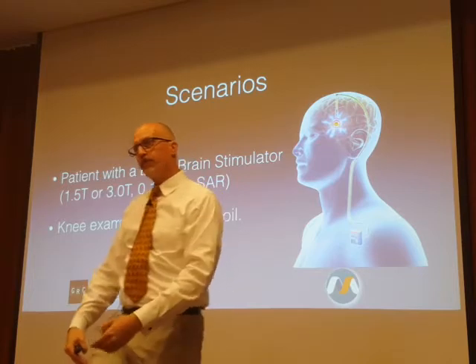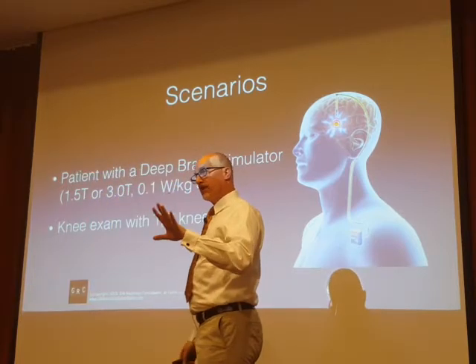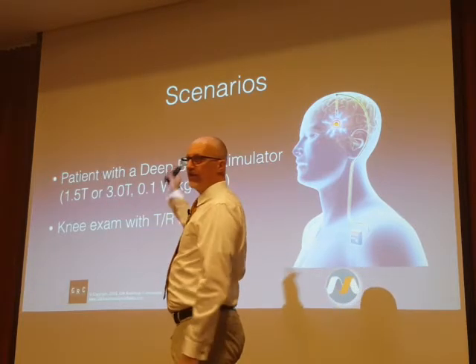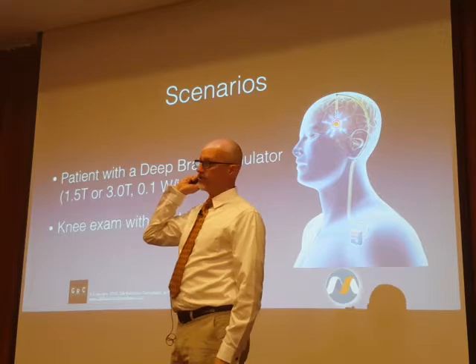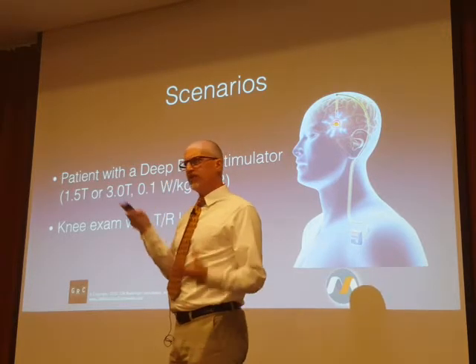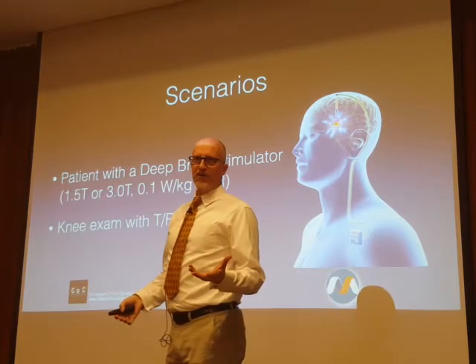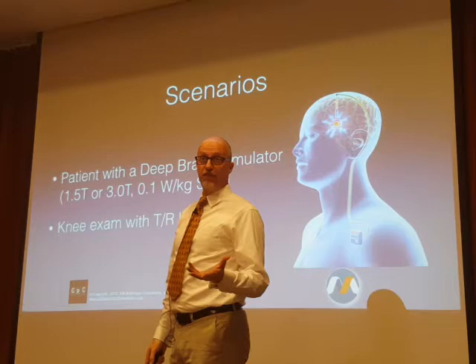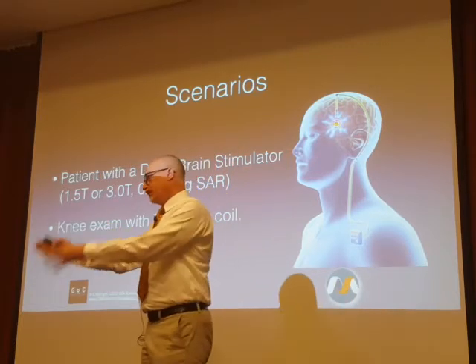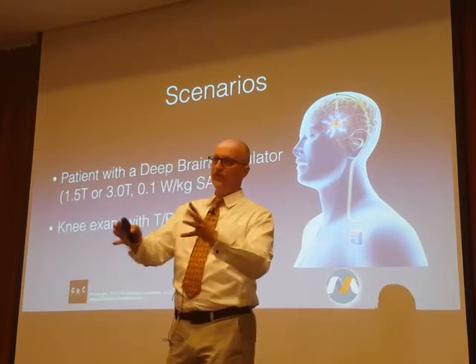Most MR conditional labels are written with the presumption that you're imaging the anatomy where the implant lives. Which means that if you're imaging something other than where the implant is, a lot of MR conditional labels are not very helpful, because many times they don't describe, if you're imaging this body part, do this, but if you're imaging this other body part, do something different.